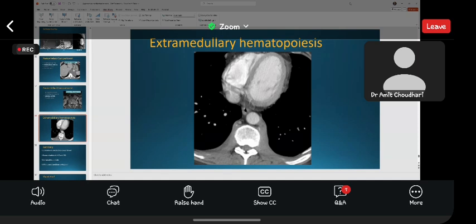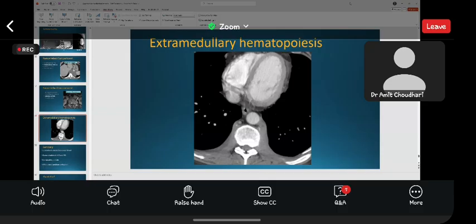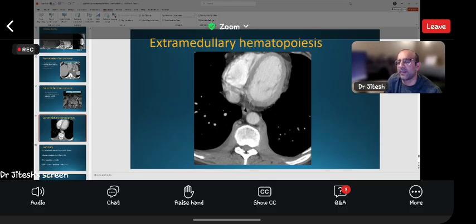What about a case of spindle cell tumor in the presentation? Is it a prospective diagnosis, or would you consider a host of differentials in such a case? When you have a mass in the posterior mediastinum or paravertebral space, the differential is mostly confined to neurogenic tumors or mesenchymal tumors, and the definitive diagnosis comes from biopsy.